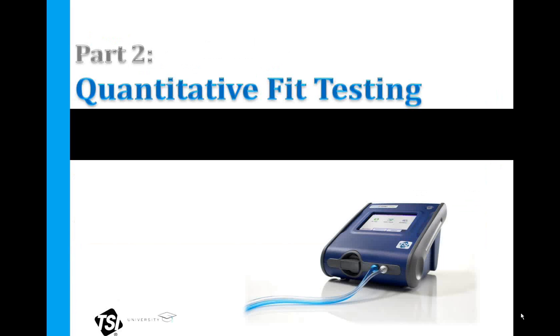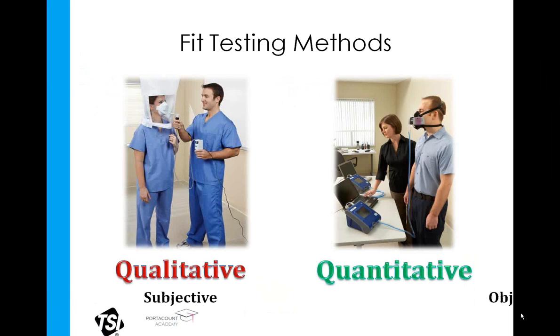So now we're going to move on to part 2, and we're going to discuss quantitative fit testing. Now first, just in case there's any confusion here, I want to differentiate the 2 different methods, or kind of umbrella terms, for fit testing. We're going to discuss the differences between qualitative fit testing versus quantitative fit testing.